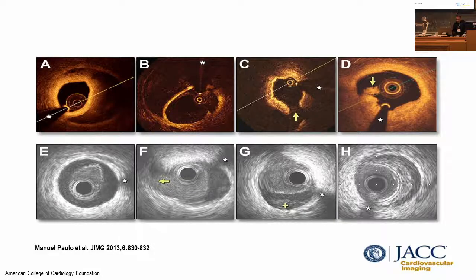This is a similar situation, and you have this hematoma, which is this shape. Sometimes it's this shape. This one, look at the IVUS, it gives you some more detailed examination of this, because this is a hematoma, but then there's clot formation now. You can see this layer of clot. And the clot sometimes can be in the lumen. In this particular case, it's a more well-formed hematoma, and then the clot is inside the lumen. So I think these imaging modalities are complementary, and give you a bit of different information.